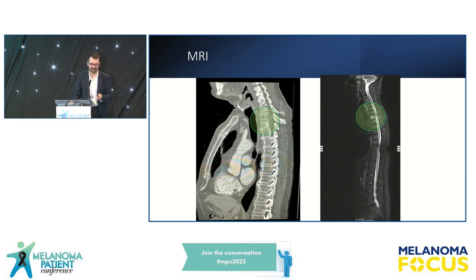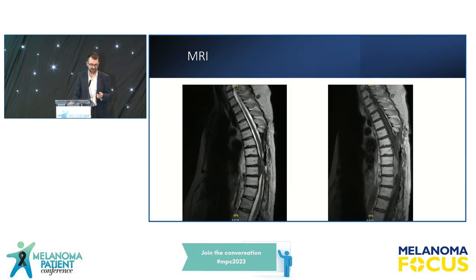And similarly, in this case as well, this patient was complaining of weakness and numbness in their lower limbs, and there's a deposit here in the spine, pressing on the spinal cord, and the patient went on to see the spinal surgeons for this to be resected.